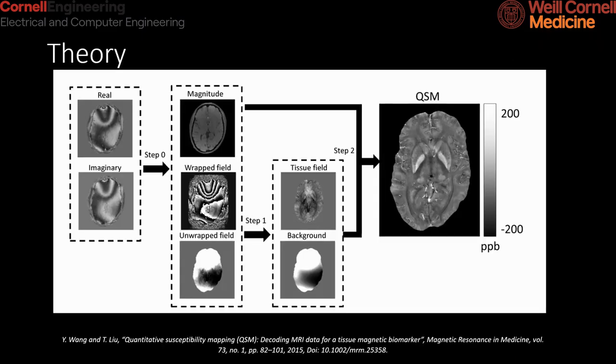An overview of reconstructing the QSM from multi-echo gradient echo phase data is shown. Although the QSM is derived from the phase data, the magnitude image is used to regularize the cost function that reconstructs the best map from corrupted data. Conventionally, the magnitude image is used to generate a mask M that will be discussed in later slides.